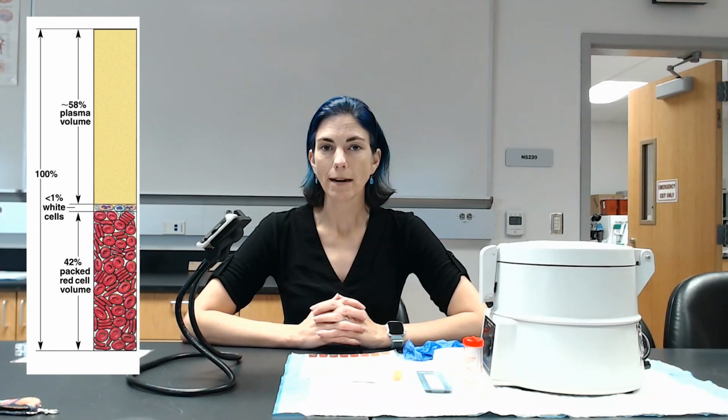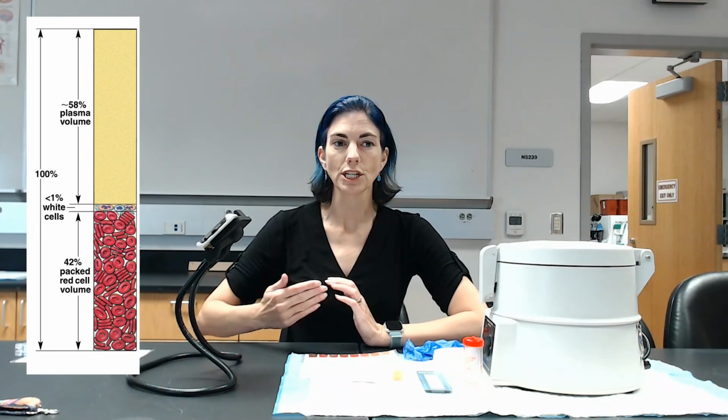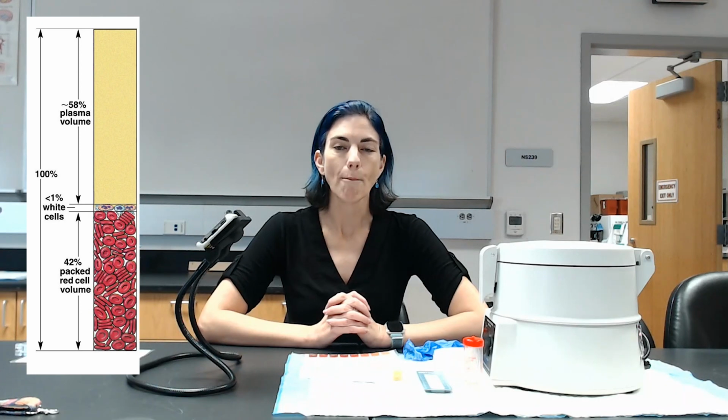Now, what's going to happen is the blood is going to separate out into its red blood cells, which are heavier. They're actually going to get pushed down. And then the plasma, or the watery component of blood, is going to stay at the top. So it will separate our blood out into the cellular elements, which includes red blood cells, white blood cells, and platelets. But as you hopefully know from lecture, most of those cells are red blood cells. So we can use the cellular layer as an approximation for red blood cell amount, and the watery component, which is plasma. So again, we're going to separate out the blood into the cells and the plasma.